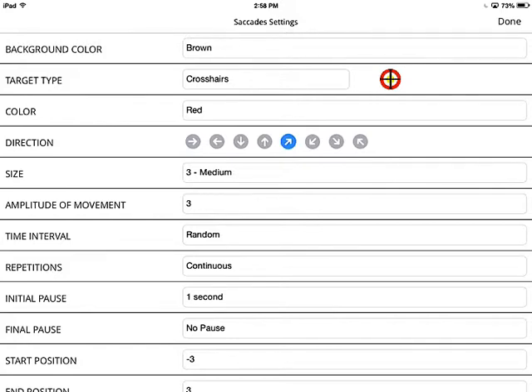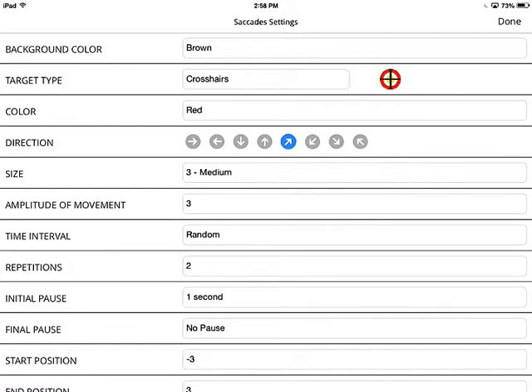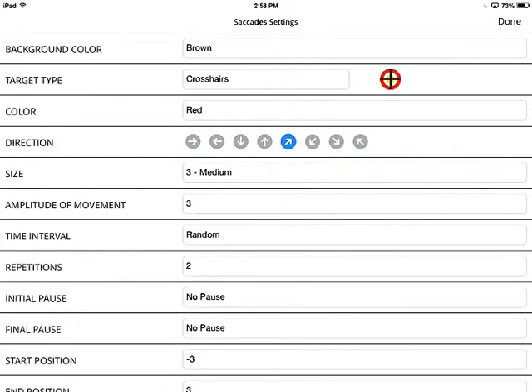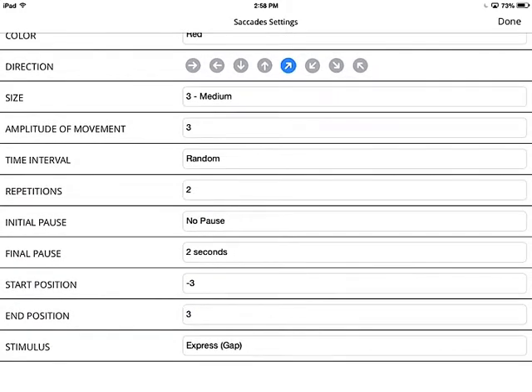Repetitions, like with pursuits, can be continuous or up to 100. Let's make it two for now. We find that repetitions work better than a timer — we previously had a timer instead of a repetition option. For initial pause, let's make it no pause so it starts right away. That's not a feature I often use — I much prefer having it hold before we start. Usually a two to three second hold is good because it gives the patient time to turn it on and then begin the exercise.